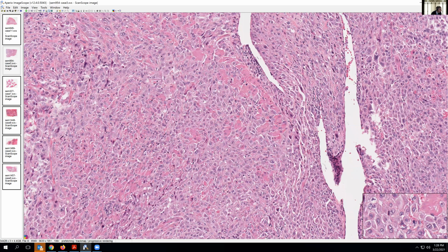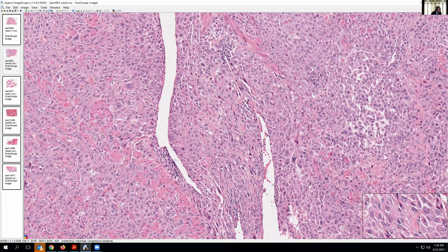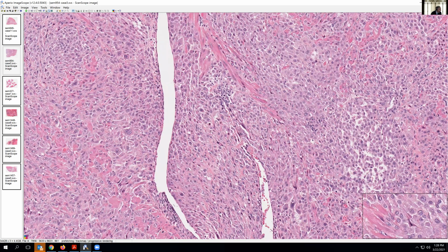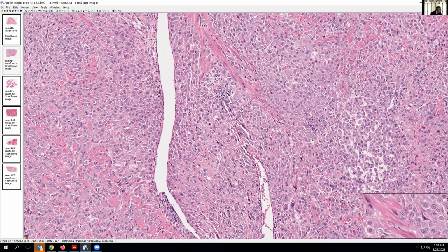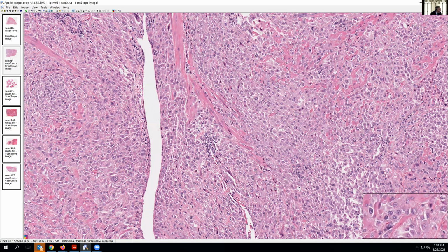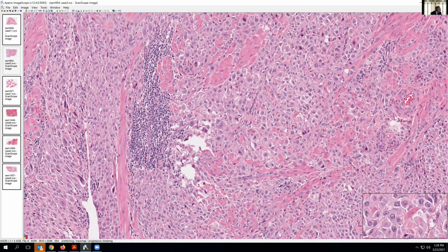So this is a rather unusual tumor in my experience, but something that you need to be aware of and that enters into the differential for uterine masses that can occur post-gestation and may be mistaken for metastatic tumor or possibly even PEComas. Now, in contrast to some of those lesions, PEComa would usually not infiltrate through the myometrium in this fashion, whereas metastatic melanoma or other sort of metastatic lesions might have this kind of an appearance. So I can see this entering into the differential of a number of entities.